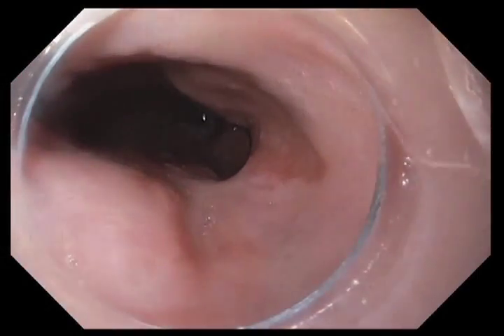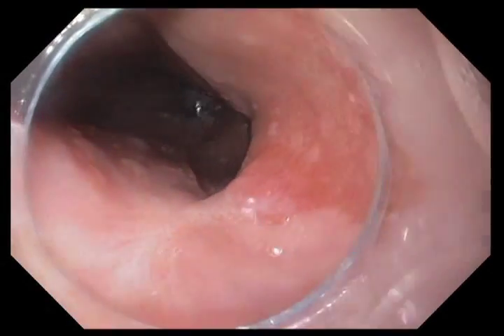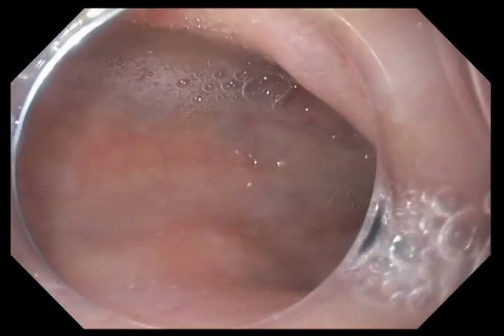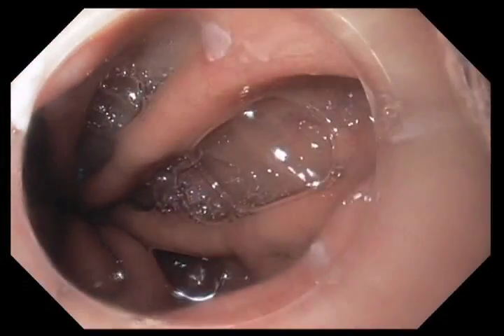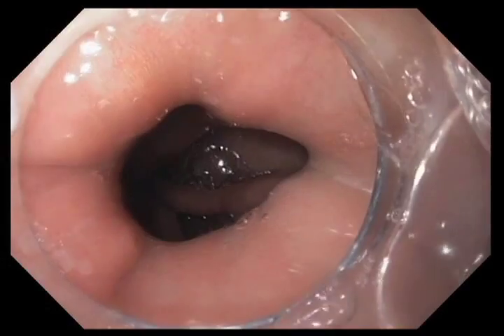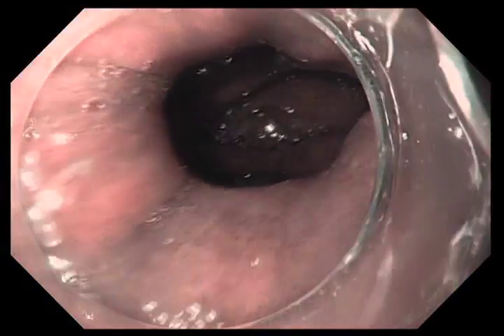This video sequence is going to show the treatment of dysplastic Barrett's esophagus with a technology called the Halo 360. This is a radio frequency based device that's mounted on a balloon. The first task is to examine the esophagus. We're using white light right now to examine the Barrett's esophagus. You can see that there's a cap fitted on the end of the scope, which is very important particularly when using narrowband imaging or NBI.